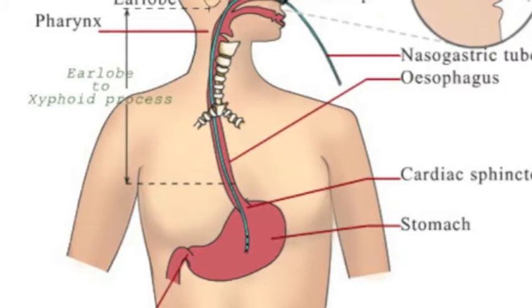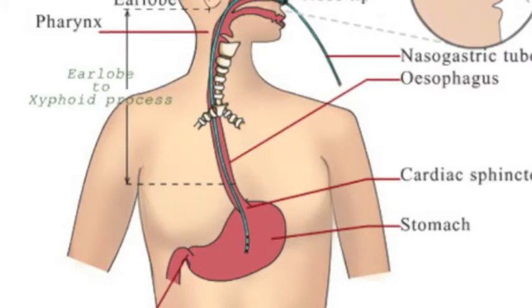You can put these down early. Sometimes in the emergency department, if they've had facial trauma and we can't get it in the nose, we'll slide it down along the ET tube, which is cool for us because it's only going to go in the right spot, since the ET tube is in the trachea. So that's what we do. So we measured it, moved it up.